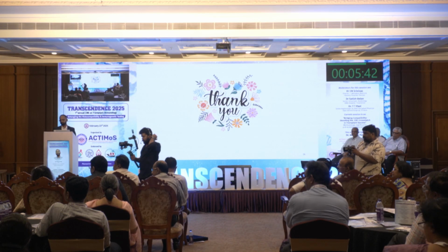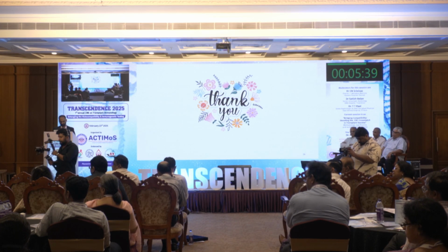I've had some experience with this some time ago. This was with regard to IgG positivity, which is an auto IgG. We've found it in less than 1% of cases, but we do get it. Invariably in all of them, even the auto crossmatch picks it up, and DTT doesn't clean it at all. When we went back to figure out whether these patients had an underlying autoimmune disorder that could explain the antibody, out of the cases we had, I don't have the exact number with me right now, but less than 50% actually had SLE or an SLE-like disorder. So I'm not really sure what caused that antibody.